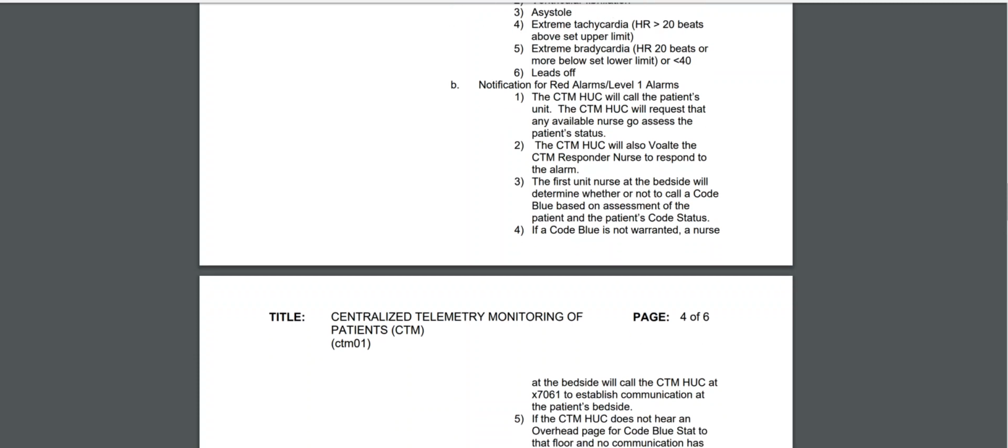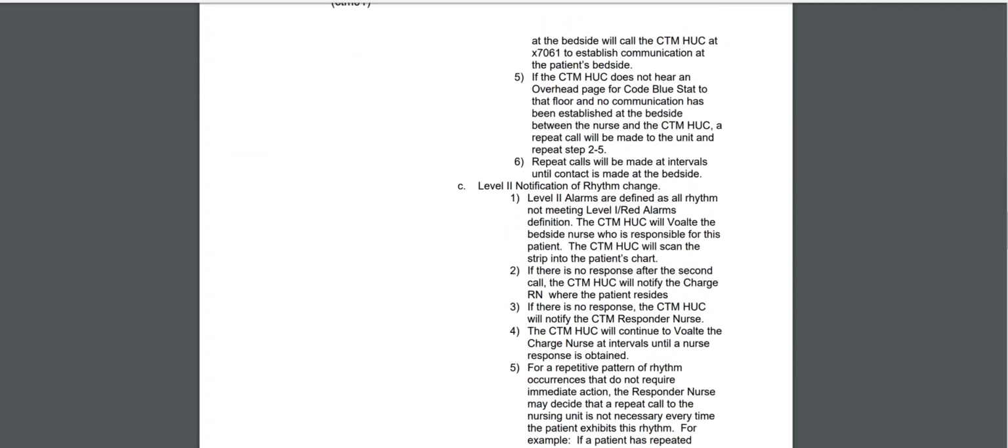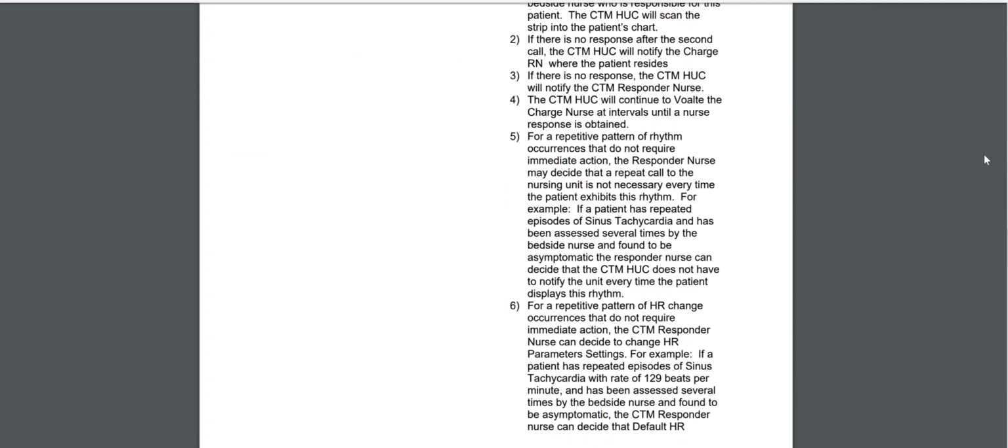Every time we go to check on that patient, we're looking for ineffective tissue perfusion, if they're having signs of a heart attack, or decreased cardiac output. Are they having signs of heart failure? That tells me if they're potentially unstable. When we have these rhythm changes, we are going to interpret them, document them, and report them. And we'll correlate to how stable they are. Again, it's important to check your patient when they're having this experience.